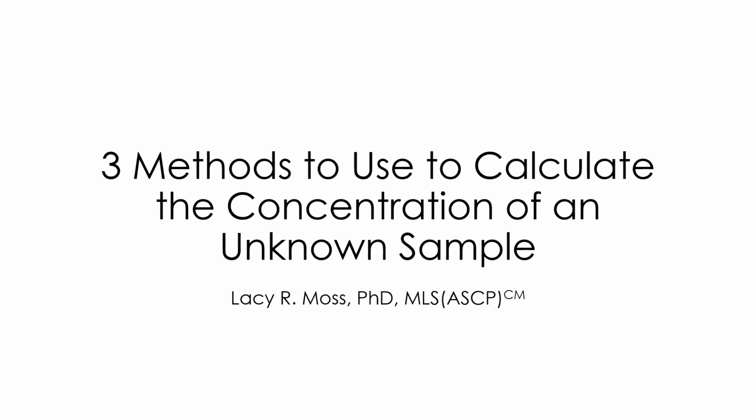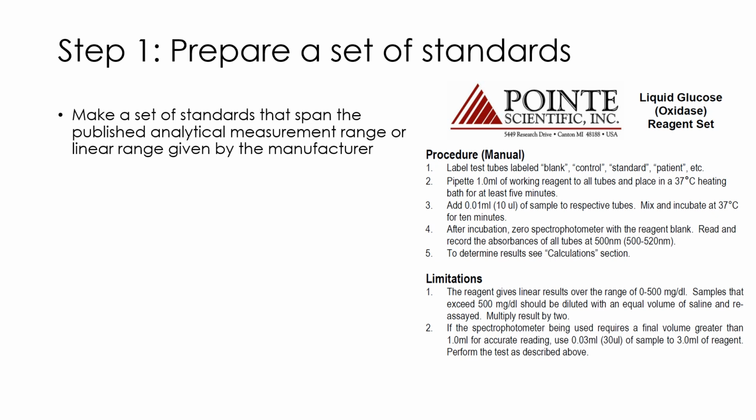In this video, we're going to discuss three methods that we can use to calculate the concentration of an unknown sample using a standard or a set of standards. The first step we want to take is to prepare a set of standards that span the analytical measurement range or linear range of the assay. The product insert provided by the manufacturer will tell us that range.